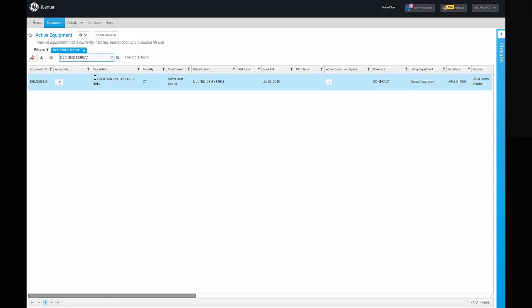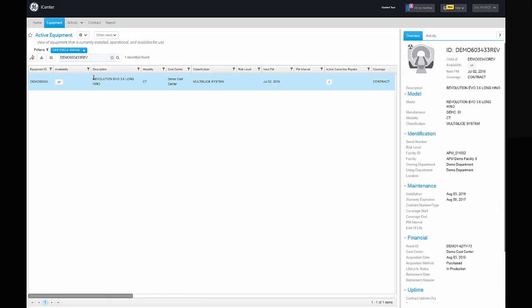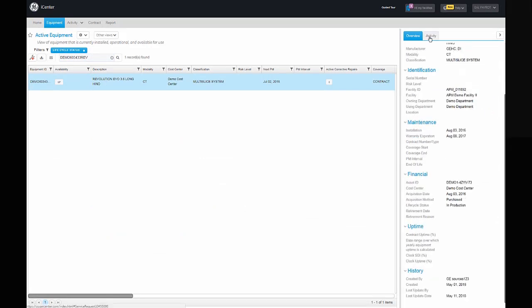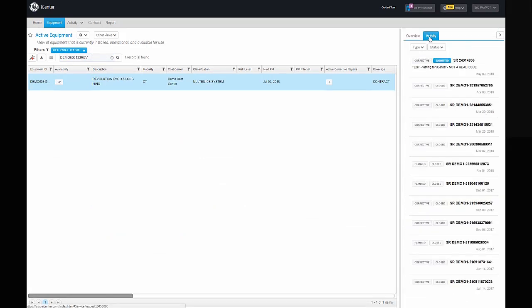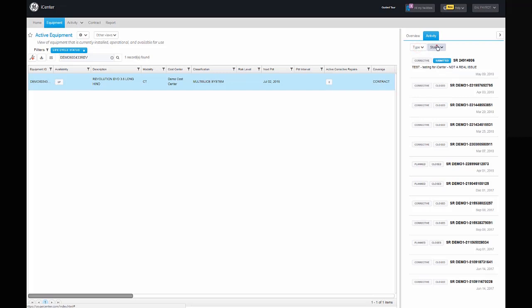You can view details like availability, planned maintenance, and service coverage. The equipment service history can be viewed under the Activity tab, and the data can be filtered based on the type of service activity or service request status.